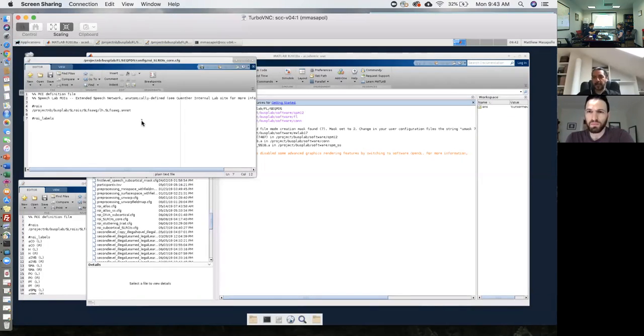Okay, great. Another small question, which I think Saul raised in one of the prior sessions: here it says left hemisphere, but I believe you said it's doing it for the whole brain. Is that correct? Right, that's true. When you specify LH something, the toolbox will look for whether there is also an RH equivalent file in the same directory, and it will use both. Okay, wonderful.